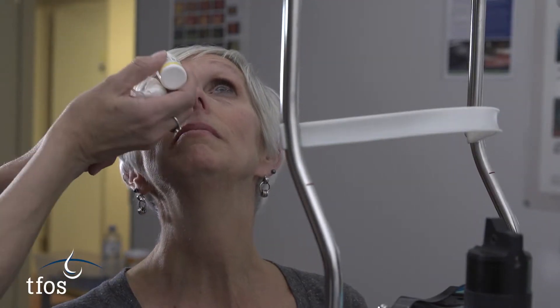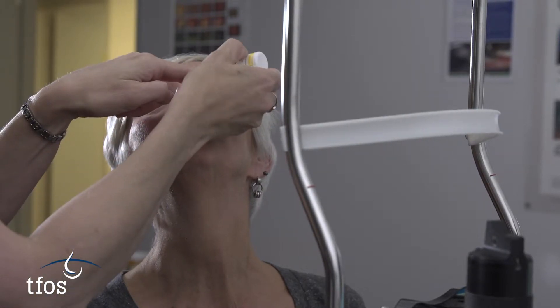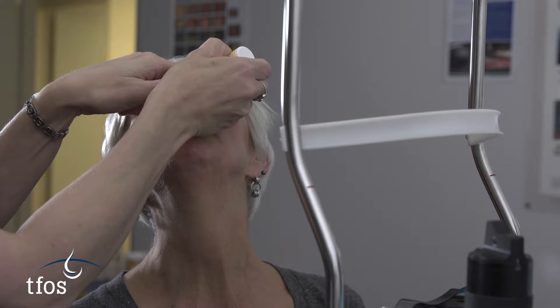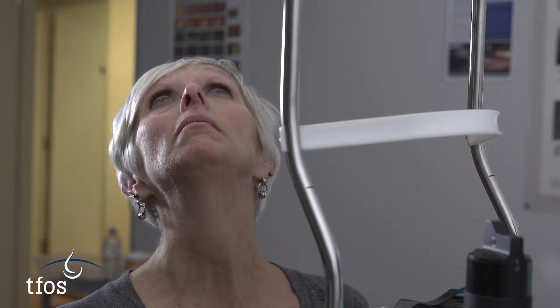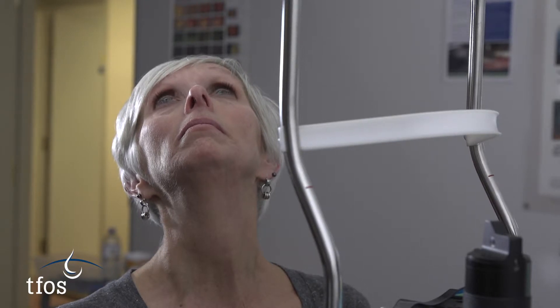When the glands are warmed sufficiently, a drop of topical anaesthetic is instilled in both eyes. Although this has minimal numbing effect on the eyelids themselves, it helps the patient to remain still and refrain from excessive blinking throughout the procedure.